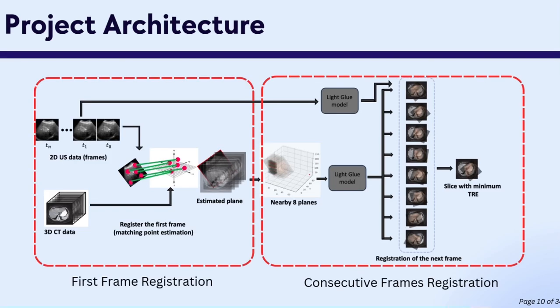Let's focus on the methodology section. Our project involves two main blocks. One is first frame registration, which is aligning the first ultrasound frame with the CT volume, and the other one is consecutive frame registration, aligning the subsequent ultrasound frames by leveraging the previously registered frame.